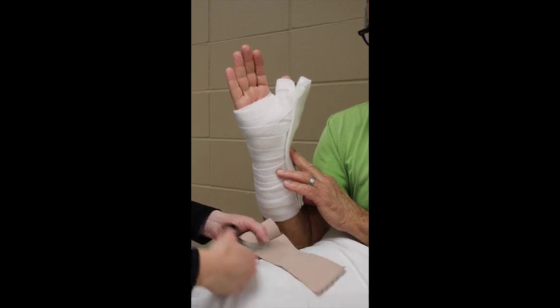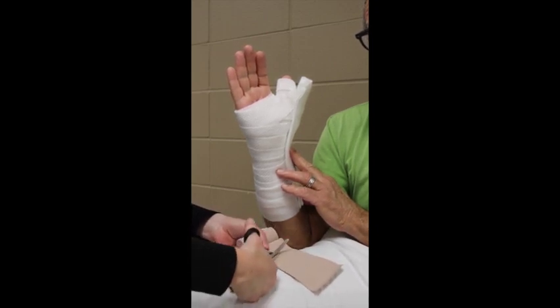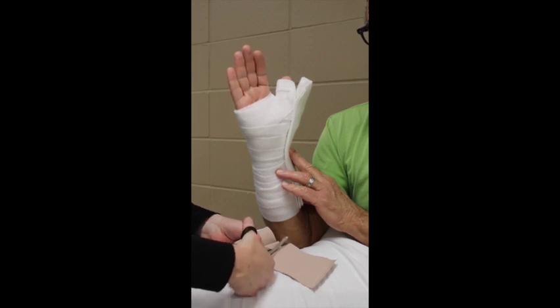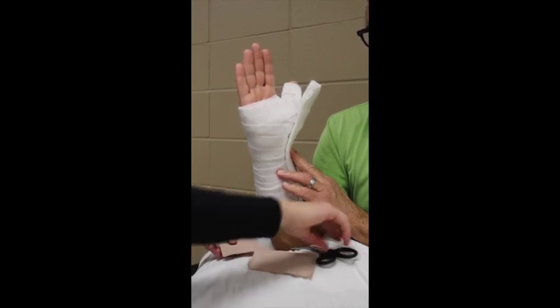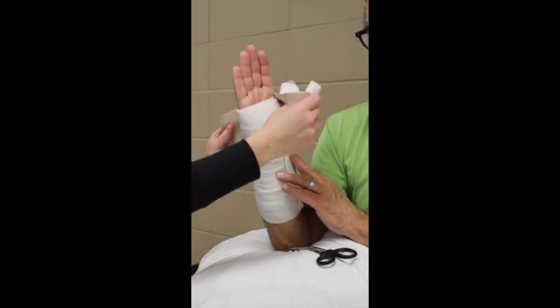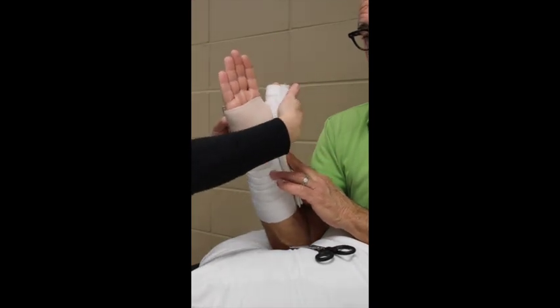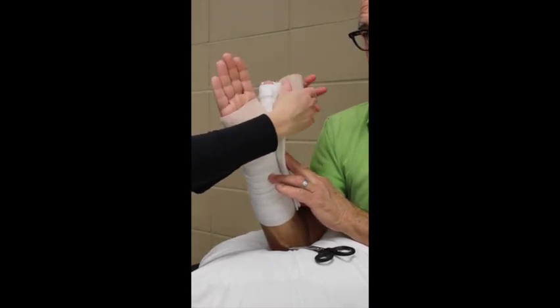I have asked the patient to help hold the splint while I get the ace wrap ready. I make my cut about four to five inches in — this goes in the first web space. Laying the ace bandage directly against the skin and padding with about 50% tension, I go around the hand and up around the thumb.